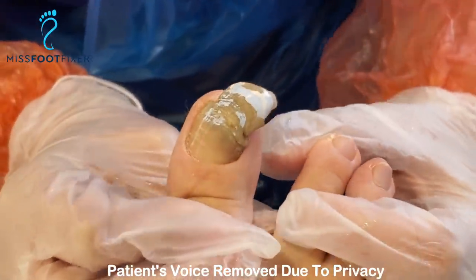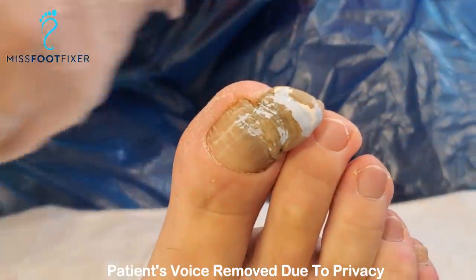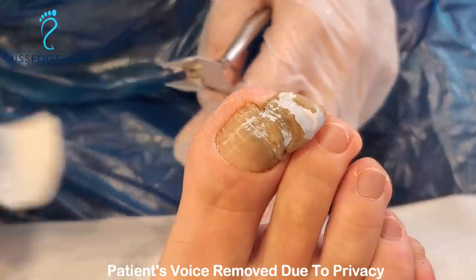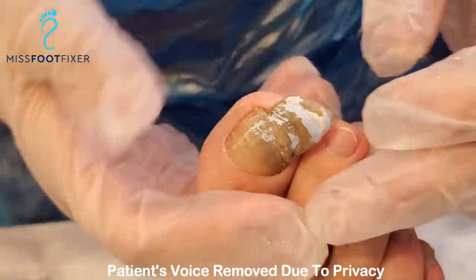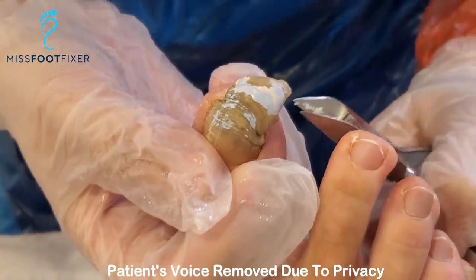It's so beautiful, it's so long. The diagnosis is damage of the nail, probably a little bit of ram horn nails, and potentially an infection in the nail too. So what we're going to do today is we are going to cut it, and then we're going to file it, and then we're going to send off a sample and figure out what it is.